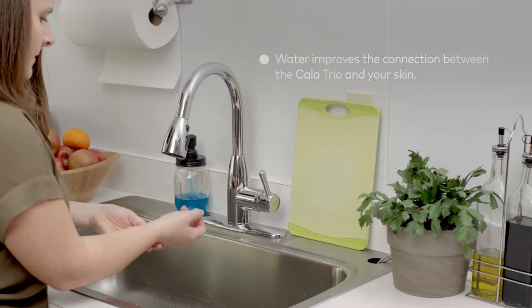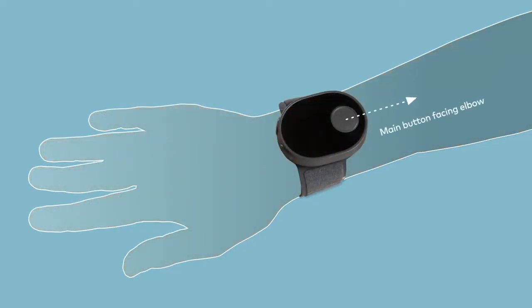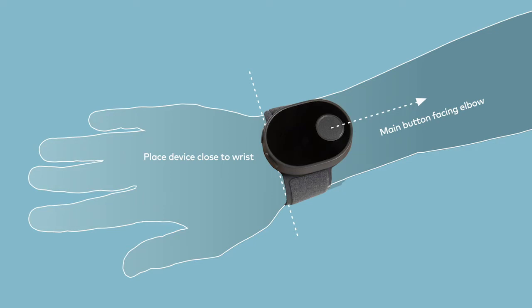Next, slide the band onto your wrist like a bracelet. Be sure the main button is facing towards your elbow. It's important that the device be positioned as close to your wrist as possible, but not covering it. This will enable you to move your hand freely during your therapy session.